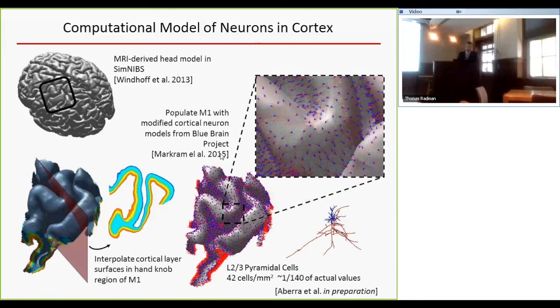We have also run, at Duke, our first study with repetitive stimulation with different pulses. One of them is conventional, and three of them are cTMS pulses. I won't go into a lot of details. The point is that we got different amounts of inhibition across the pulses when we changed the pulse shape. So the cTMS pulses are doing something, and when you look at the possible explanations, you see similar effects here. These pulses have a more unidirectional character, and we have them in different directions.